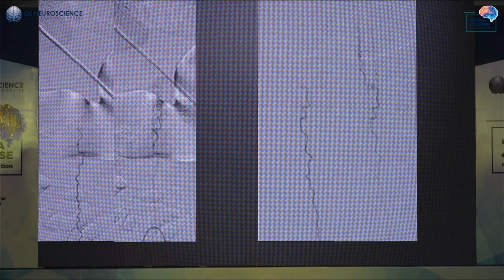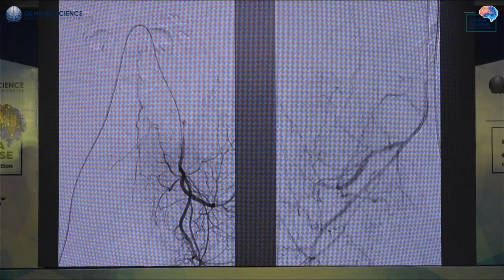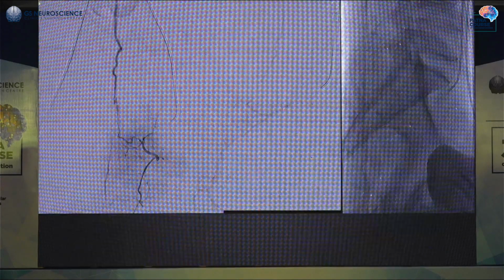This is the venous drainage which goes all the way up, and the patient presented with symptoms of dorsal cord syndrome. Practically at the dorsal level, the venous congestion was there. That was the presentation. So still, we can get through with these fistulas. We can superselectively catheterize.